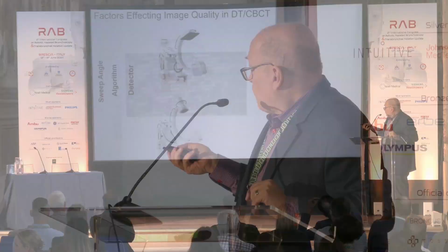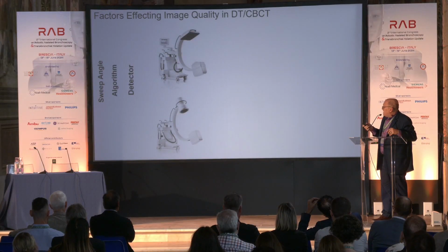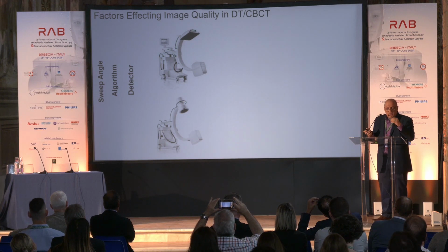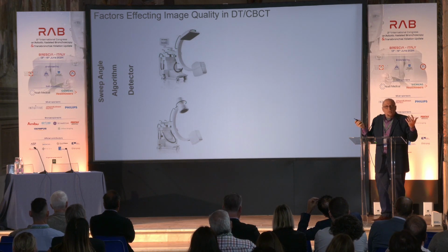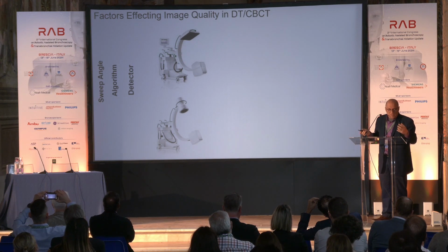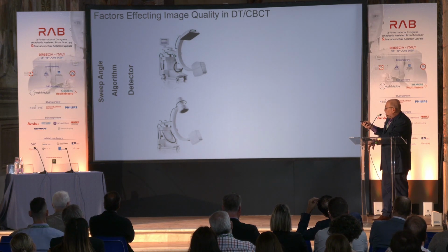Now, what are the things that affect your image quality? These are important to know because, as you'll see in a second, you can't always see nodules, so you need to be able to see them in some way if you can't see them in a standard fluoroscopic view.